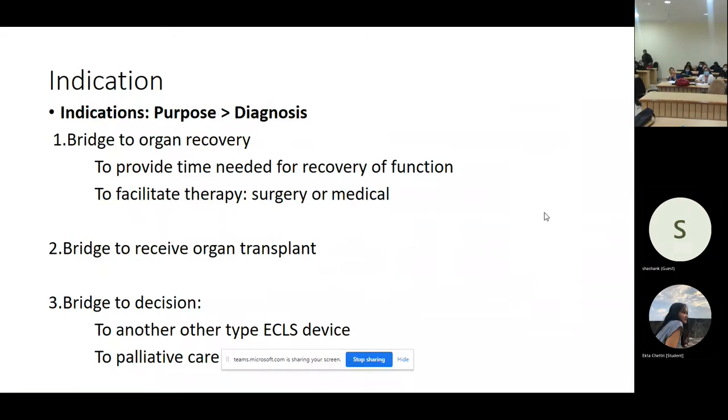But if, after all the guidelines, it is not working and the lungs are not recovering and the patient is having severe hypoxia or hypercapnia, then ECMO should be started as soon as possible to prevent permanent organ damage. So in some cases with respiratory arrest or sepsis-induced myocardial depression, the use of veno-arterial ECMO, if you remember, one cannula will be in a large vein and one cannula will be in a large artery. The use of veno-arterial ECMO is in a case of respiratory and cardiac instability. Clear till now?